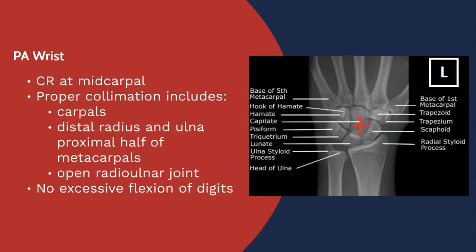You want to see an open radio-ulnar joint — that's one way of evaluating whether the wrist is appropriately positioned in terms of rotation, meaning there's no rotation or minimal rotation. One of the things we do with the wrist is flex the digits, which presses the wrist closer to the image receptor and allows for more open spacing between all of the carpal bones.